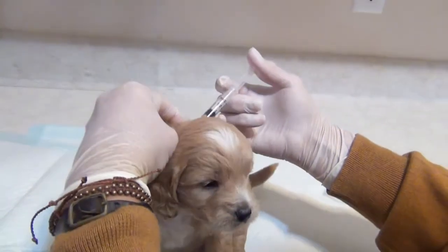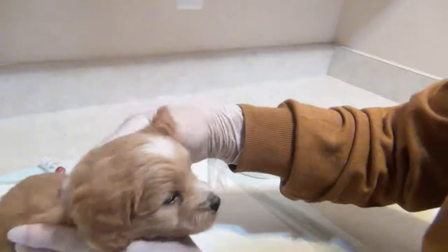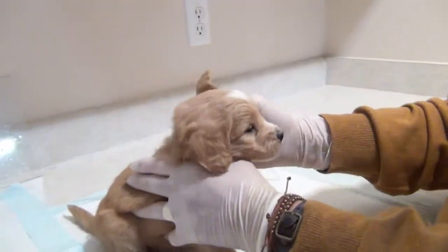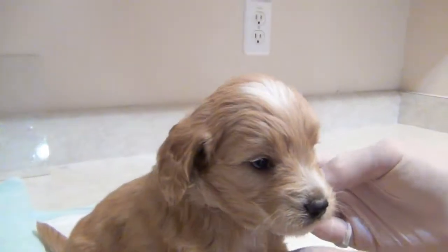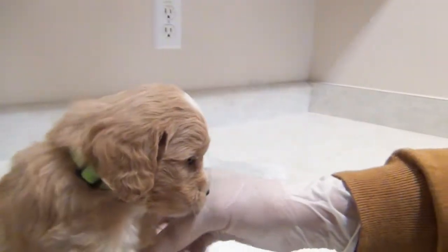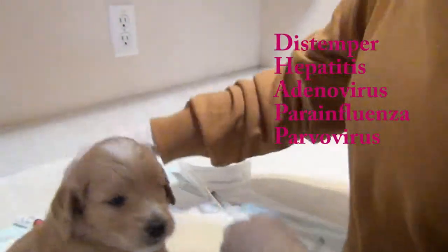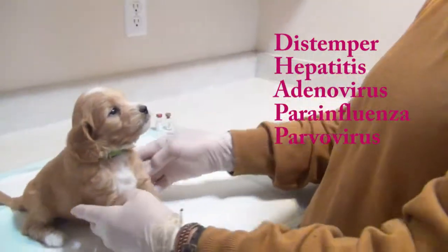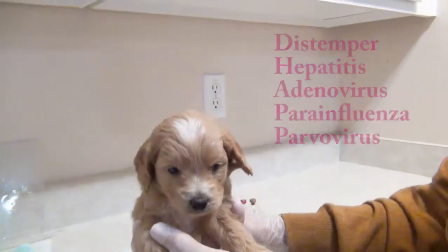He doesn't like it — most of the time they're just fine. Give it to him fairly quick, then give him a nice little rub. Have you ever seen a cuter face? And now he's a little face that's not going to get sick. What I've given him here is a five-way, which takes care of the five most prominent diseases that can affect a puppy when they're young.